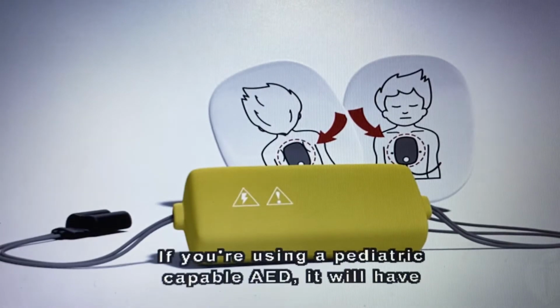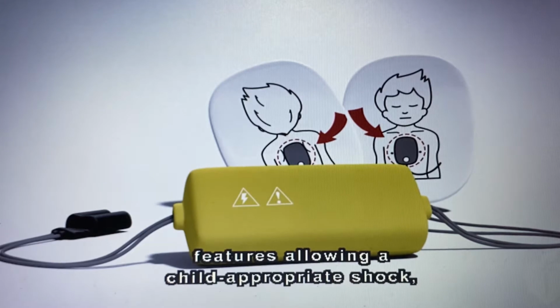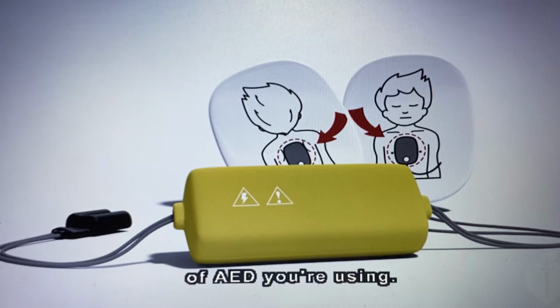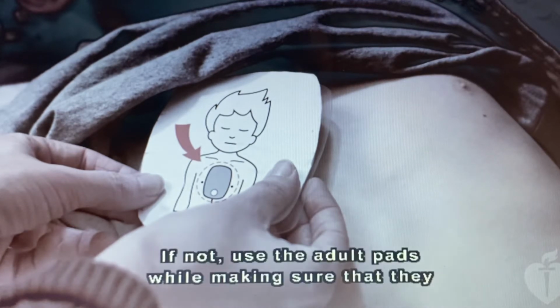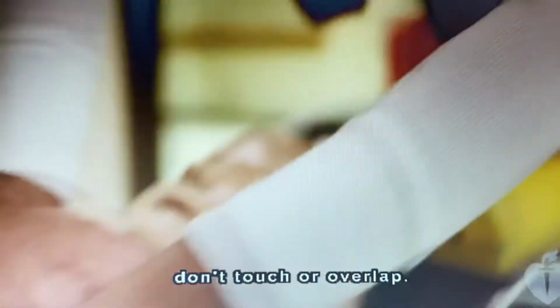If you're using a pediatric-capable AED, it will have features allowing a child-appropriate shock. But which feature is available depends on the type of AED you're using. Your AED may also include smaller-sized pads that are designed for children under 8 years of age. If it does, use them. If not, use the adult pads while making sure that they don't touch or overlap.